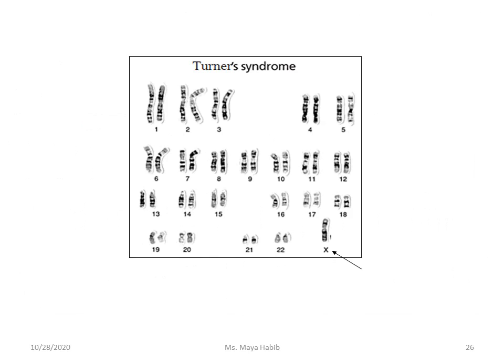In this karyotype, you can see that there is only 1 gonosome instead of 2. This is also considered a numerical abnormality, but in this case there is a missing chromosome, so in here, we have monosomy. What you have to know is that chromosomal abnormalities might be related to chromosome structure and not only number, as you will see next.